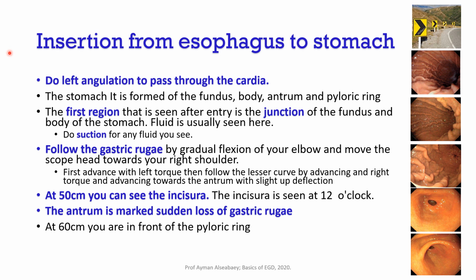I should also follow the signals in the stomach. When I want to pass through the lower esophageal sphincter, it actually deviates to the left. To pass through the cardia in a good manner, when you are facing the cardia, simply rotate the shaft of the endoscope anti-clockwise with gentle pressure. You will pass through the cardia easily without injury. This is the first technique.